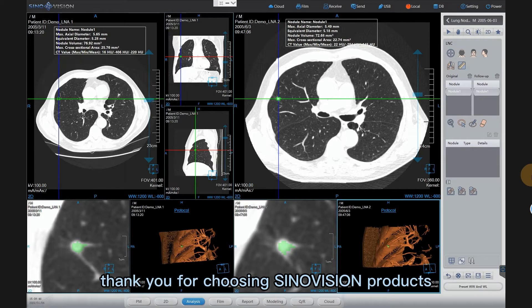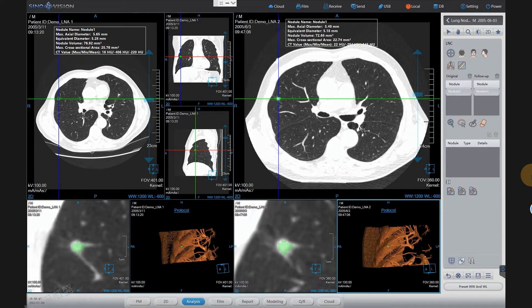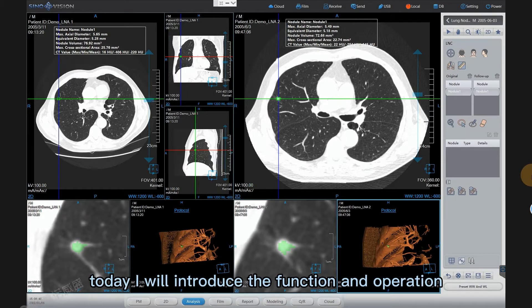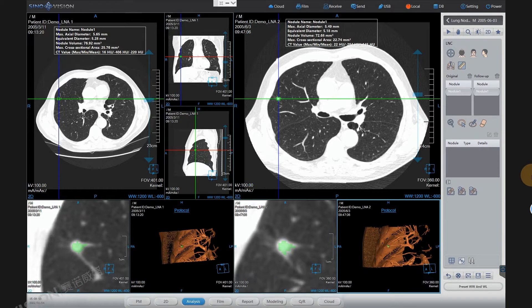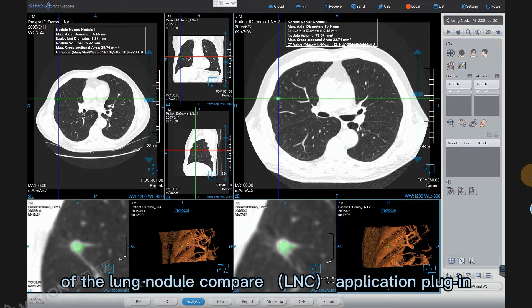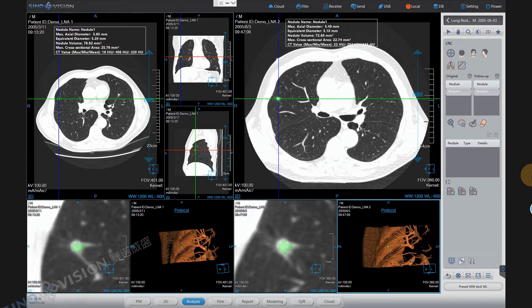Thank you for choosing SINOVISION products. Today I will introduce the function and operation of the Lung Nodule Compare LNC application plugin.